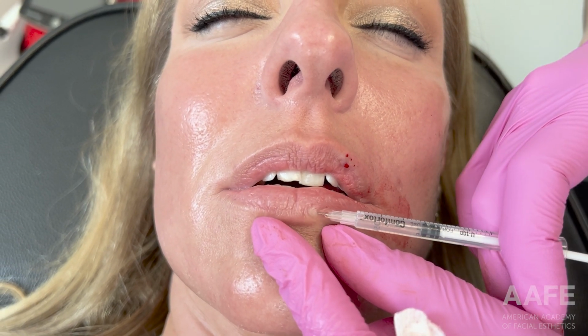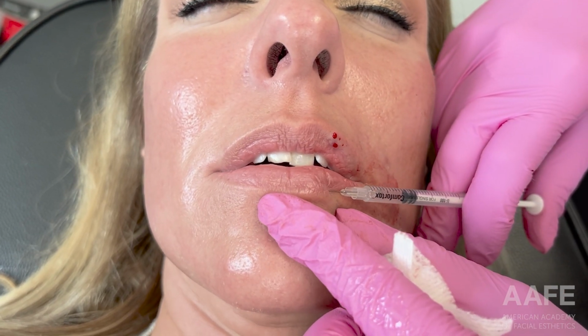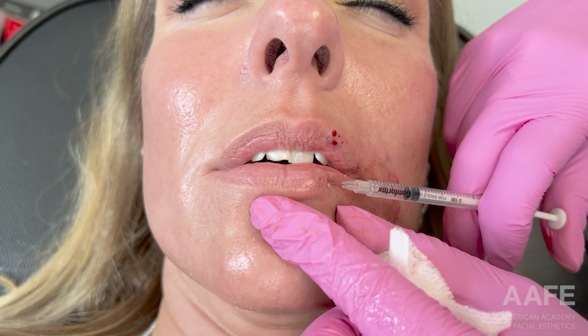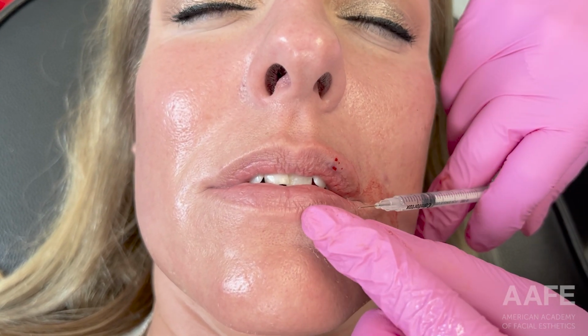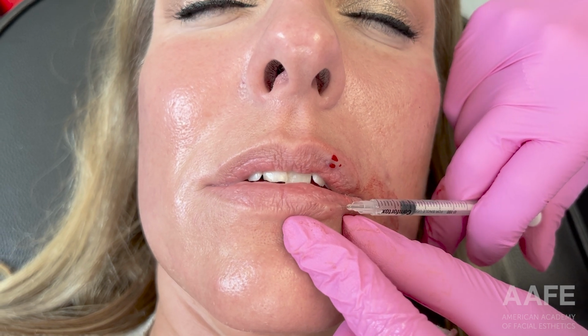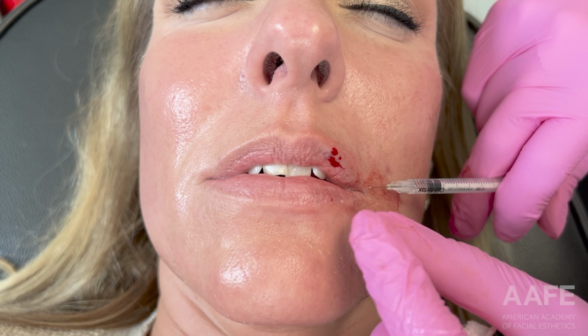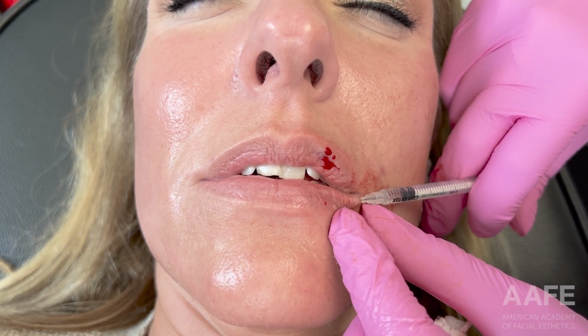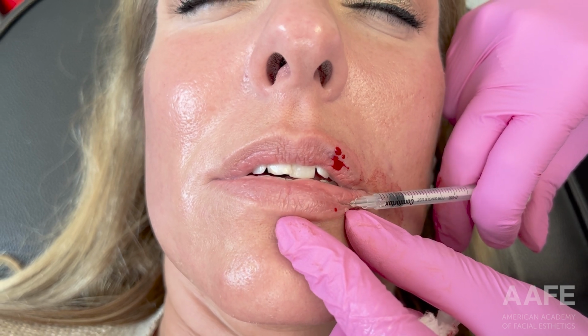You can see I'm jumping all over the place with her, and I do this pretty frequently with clients. The main reason is because I just topically numbed her, and I'm coming in and I want to give her a little bit of that lidocaine in the product all over. So for her, I'm really just trying to make sure that she's very comfortable, and you can see she is. But I really like to do a little base all around the lips so the patient does become comfortable while that topical numbing is still kicked in. And then I'll just go back and be a perfectionist after the fact.